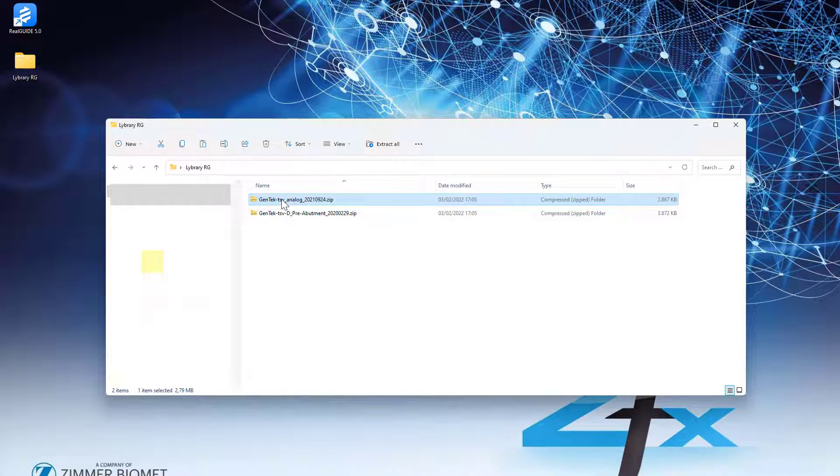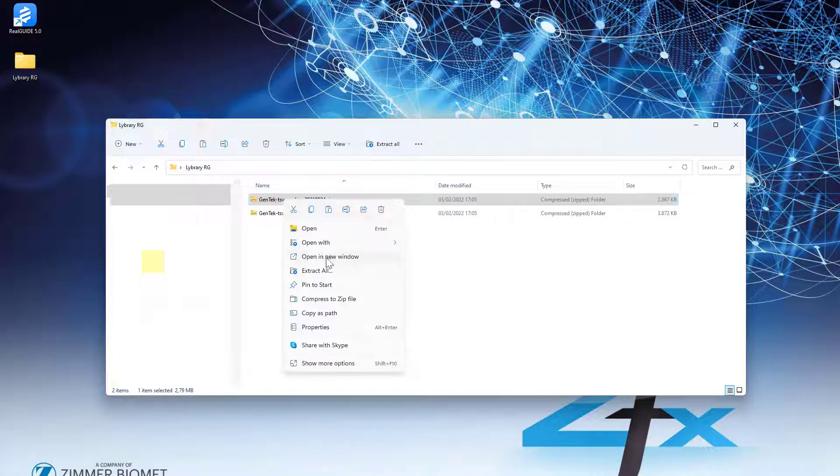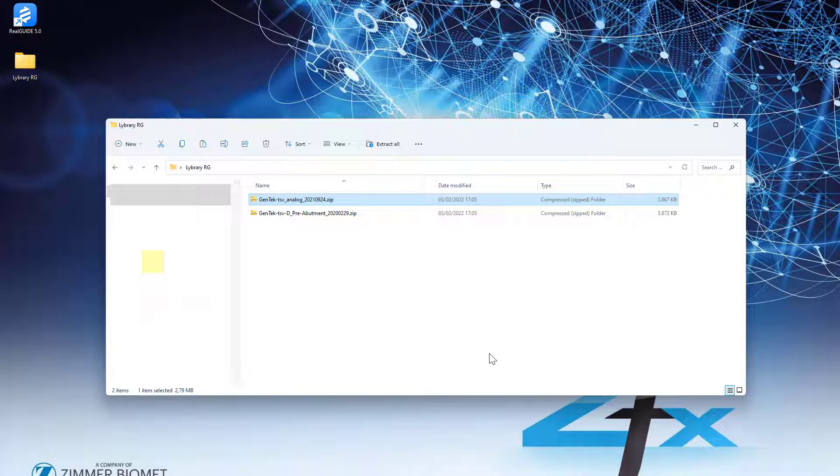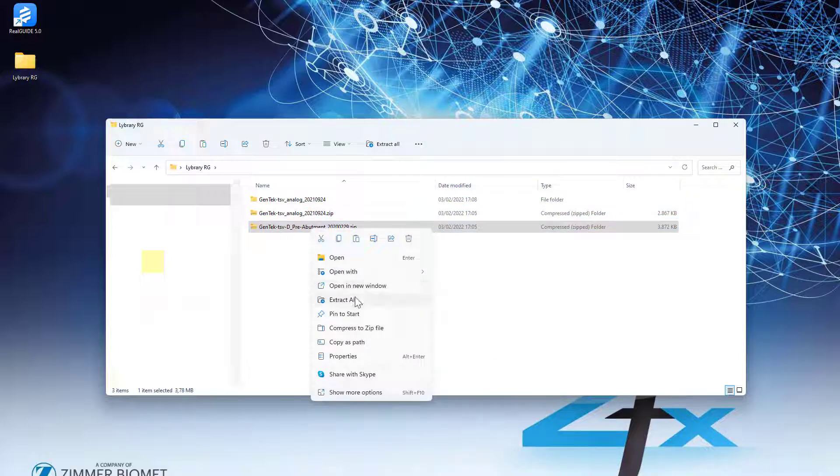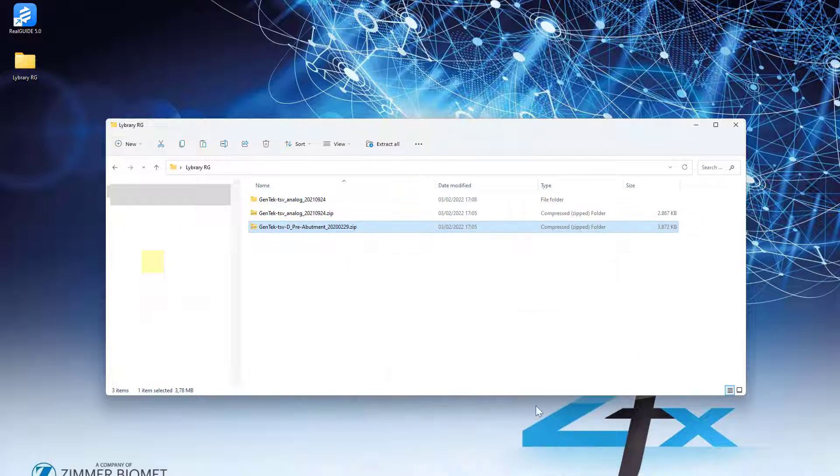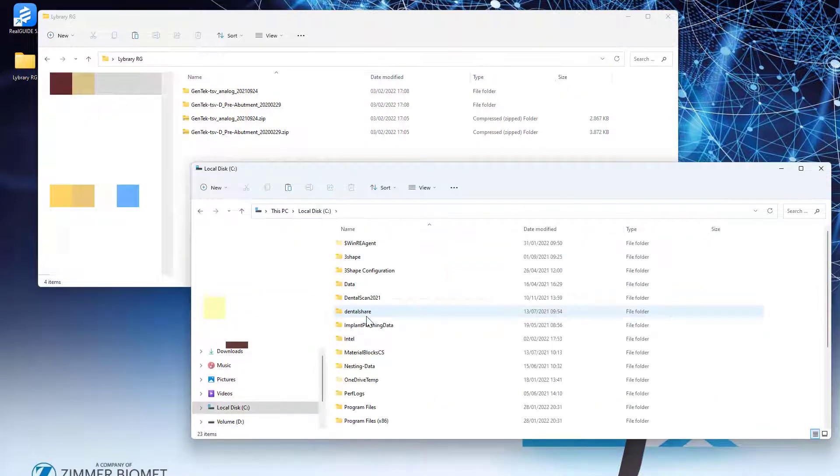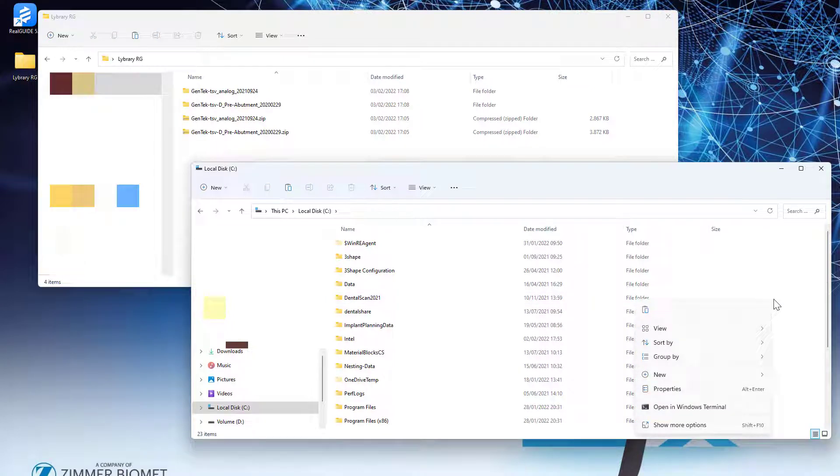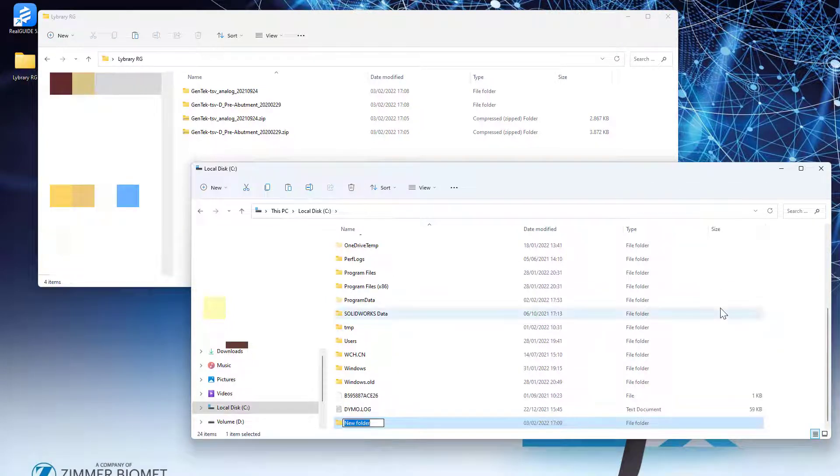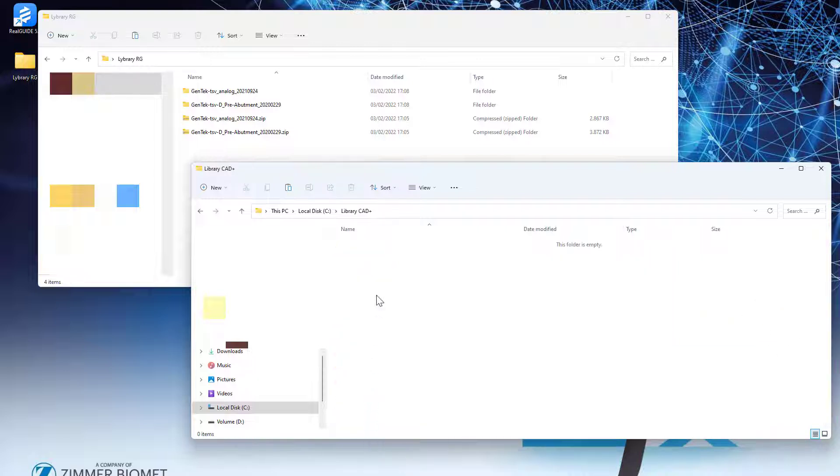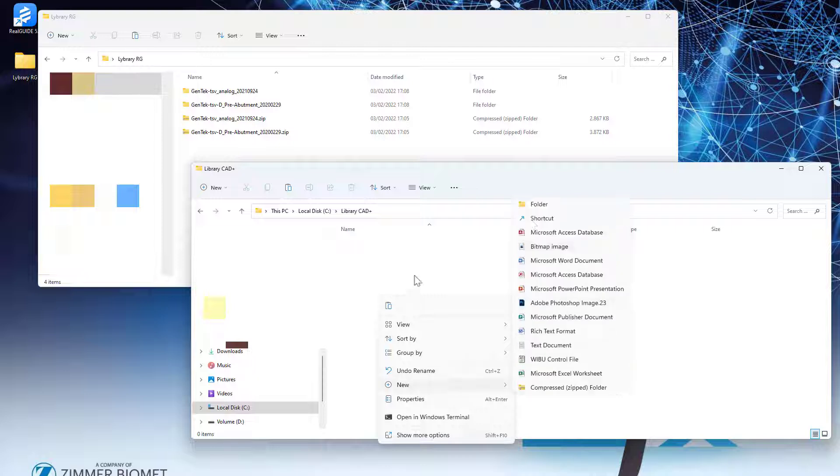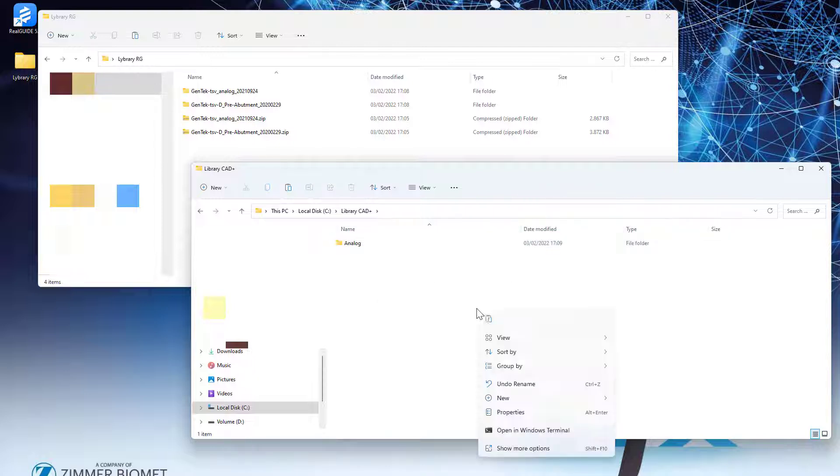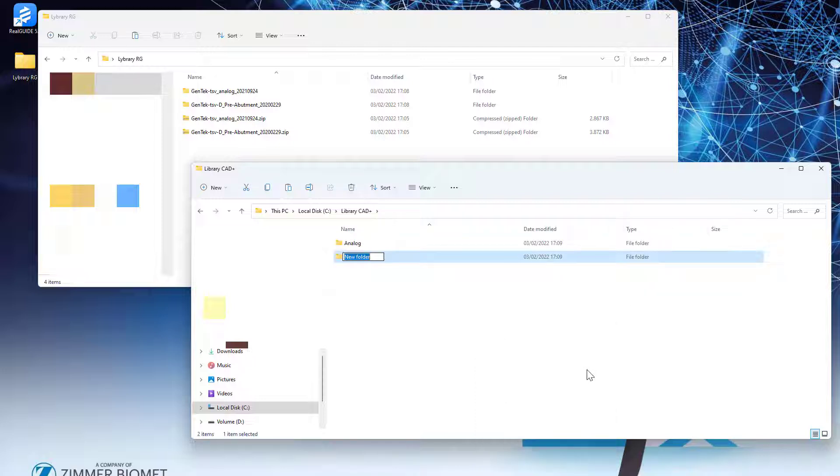Once the libraries have been downloaded, the zip files need unpacked. In the local disk C, we create the folder Library CAD Plus. And now create one folder Analog where copy-paste analog library, and create one folder Template where copy-paste pre-milled or Ti-base library.